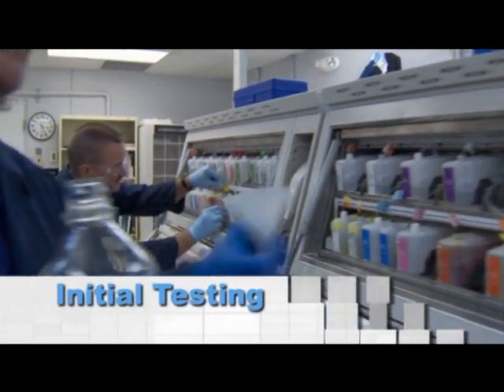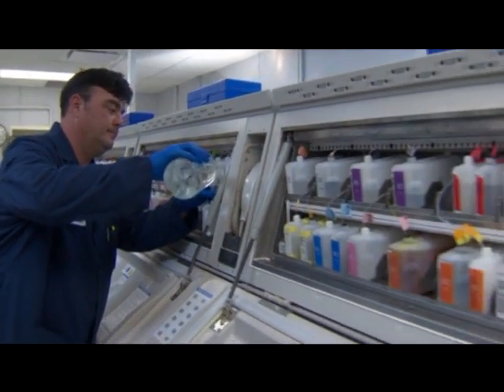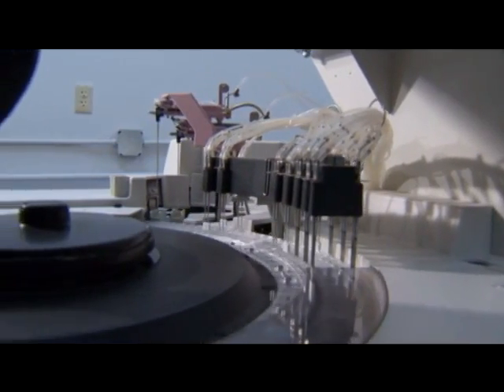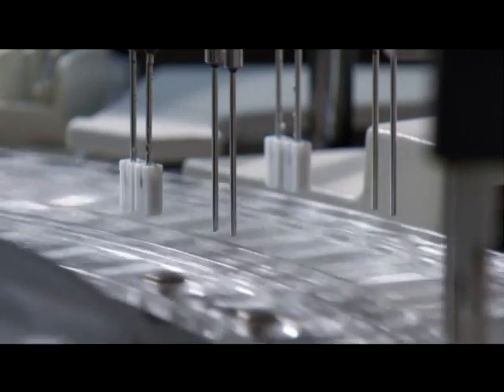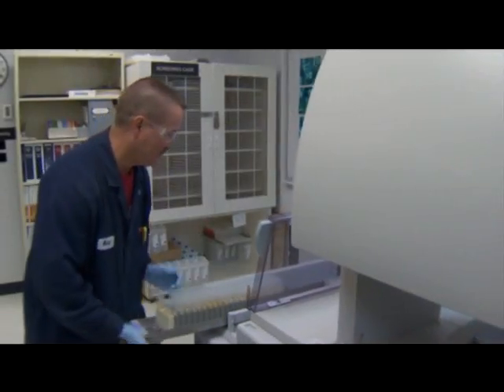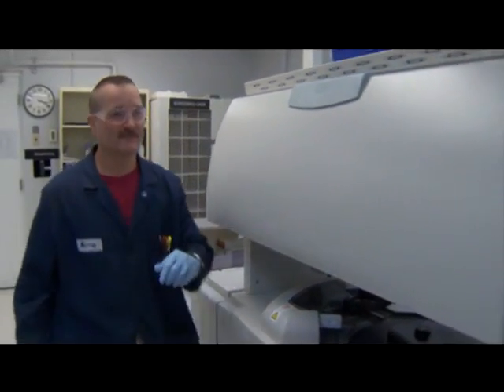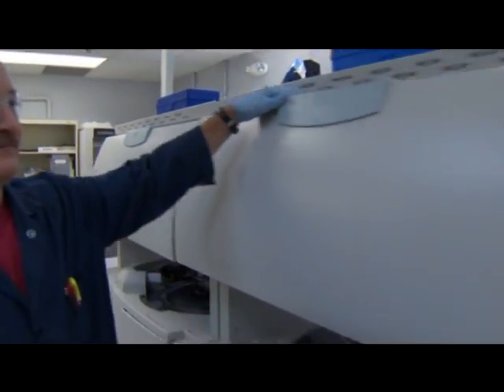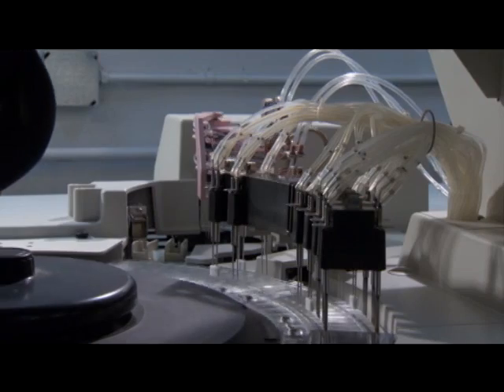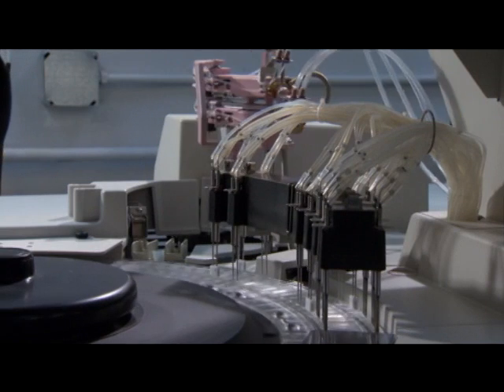In the screening division, each specimen is evaluated in a state-of-the-art automated analyzer. This instrument conducts a fast and cost-effective immunoassay test. Another very familiar immunoassay test is a home pregnancy test. Immunoassay testing uses antibodies to detect specific substances like illegal drugs. If a drug is present in the urine, it causes a chemical reaction, which is monitored by measuring changes in the intensity of light passing through the specimen.